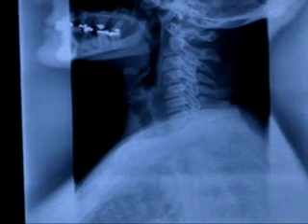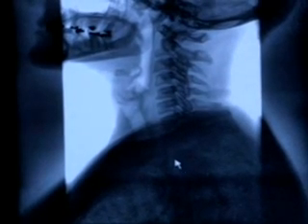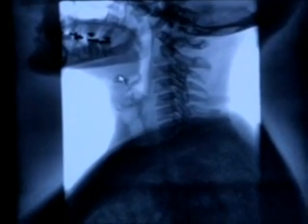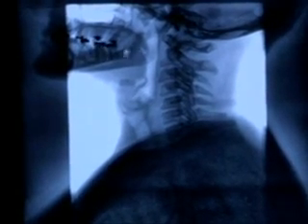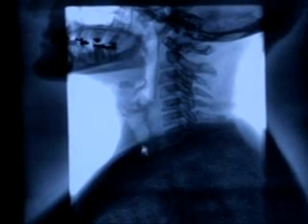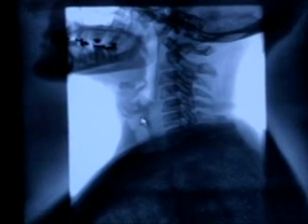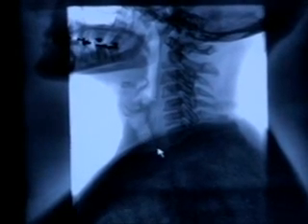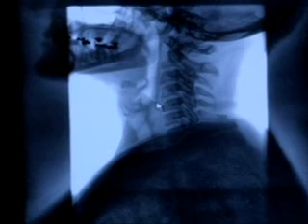Also, we could play with this image all day, if we want. We also have the ability to invert the image, which lets us look at some more soft tissue. So if we invert this, now we could see the esophagus. Here's a bone called the hyoid bone, which you typically don't see in a typical x-ray. We could see the dental work of a patient. You could see everything, including the trachea and the esophagus here. This is soft tissue, which is important in motor vehicle accidents or trauma. An indication would be distension or displacement of this organ here when we have cervical swelling or significant trauma. So if we see that this angle is too large or there's too much spacing in between this, then we know that there's a severe injury. This patient needs emergency care.